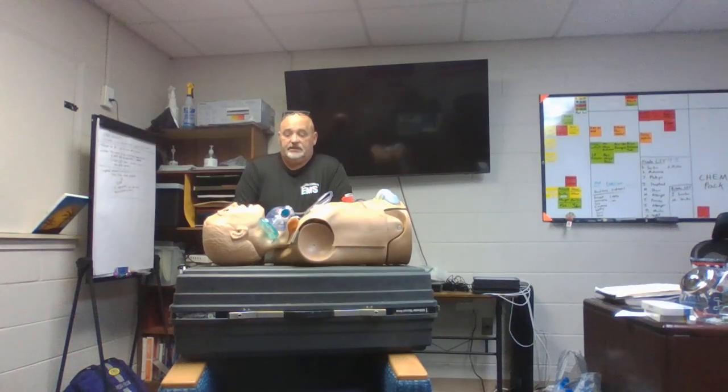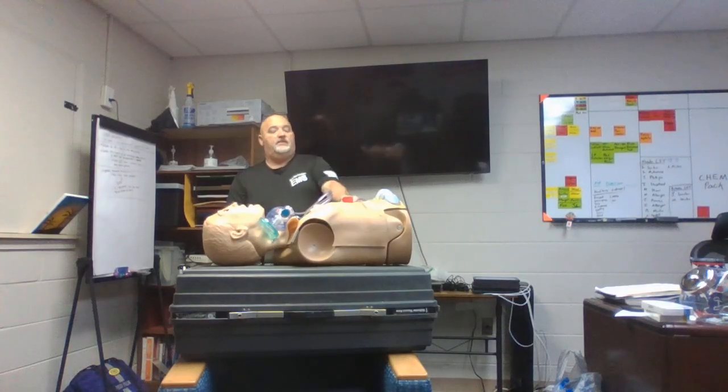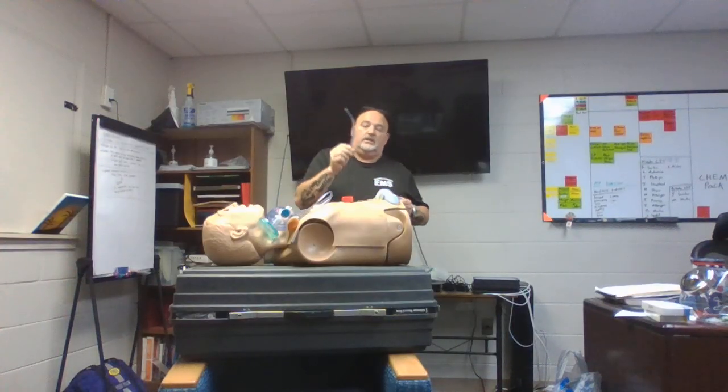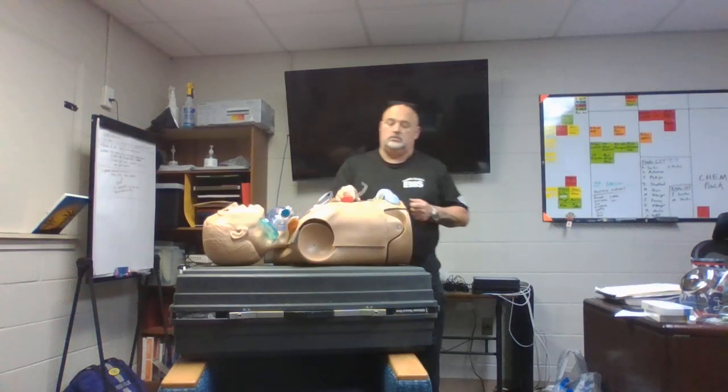So if the patient doesn't have trauma, let's roll them, right? Let's let it drain out, take a suction, suck it all out of there. We have gotten away from the Yankauers. We use a DuCanto now because they're so big. We can get chunks instead of just that little bit. So these are really hard to clog. You can, but they're a lot harder than the Yankauers.